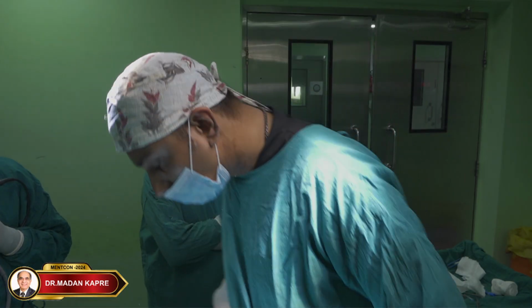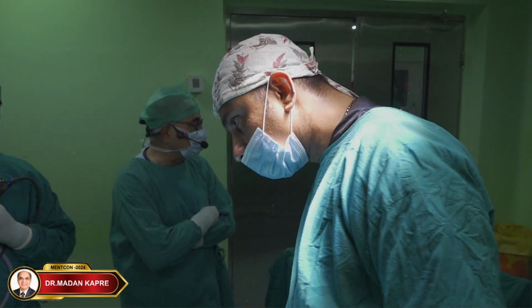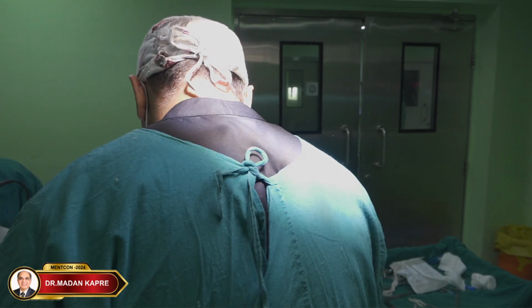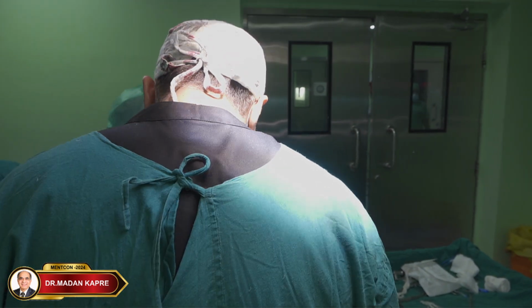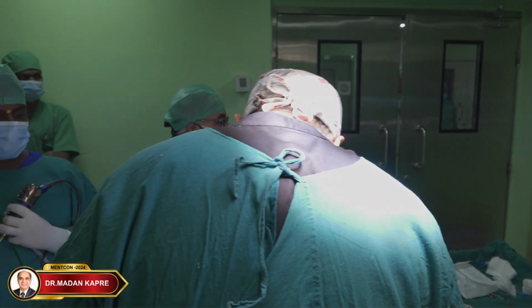Now what we have done is we have removed the molars from the upper side, and I'll introduce Dr. Kothe to you. He's getting scrubbed. He is with me, and together we have done a book on management.